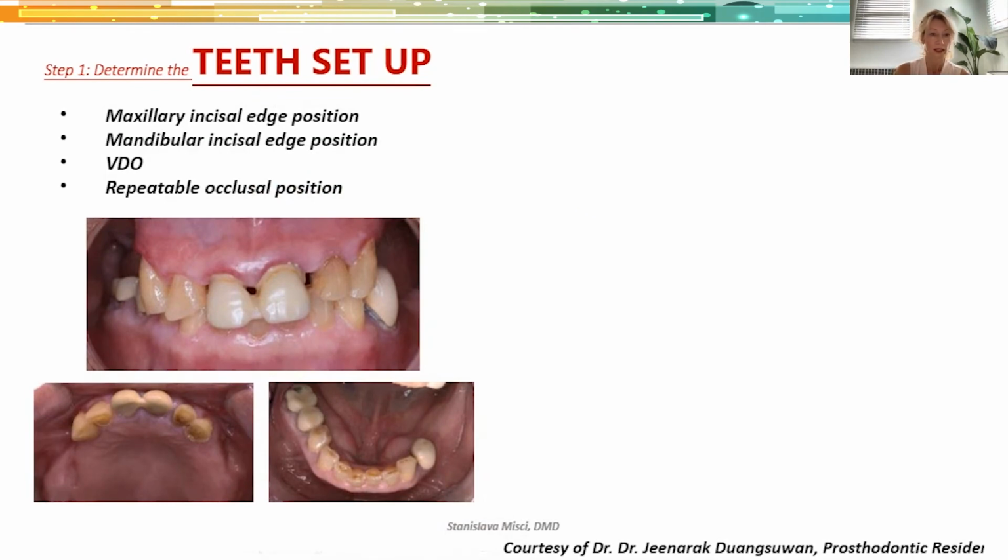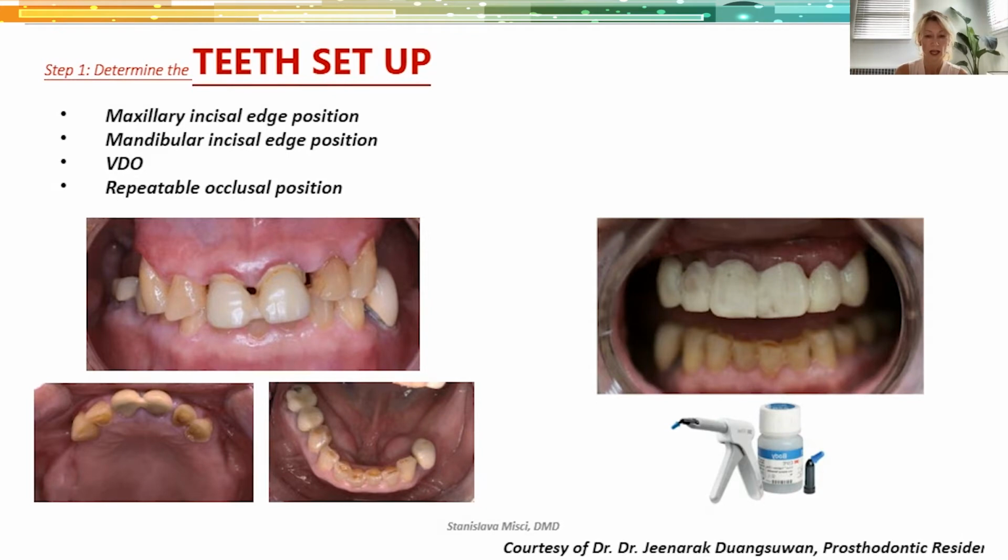So for the next case, again, the first step is the tooth setup, maxillary incisal edge position. For this case, we did a chairside mock-up with some composite. This is a case that one of our prosthodontic residents, Dr. Duang Suvan, is working on right now, and I'm supervising her case. So we're really enjoying this technology we're using with her.